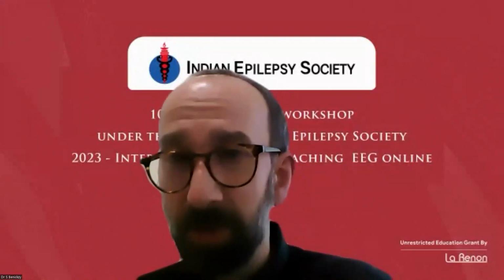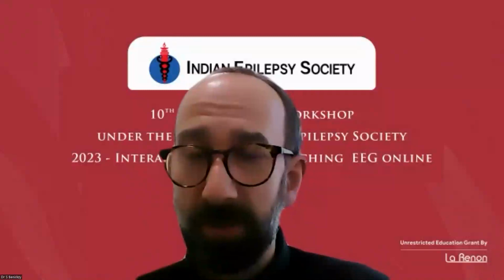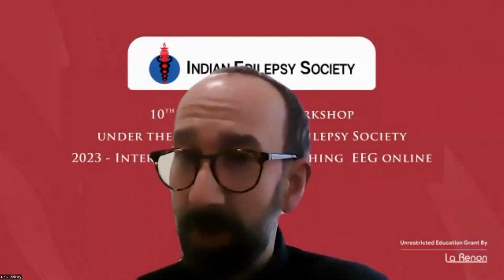So the time window is very, very important, and time is brain. The earlier you treat, the more you can save. But again, if the condition is reversible, in an intoxication for example, and if you treated the etiology and you suppress the EEG, then you have higher odds that the patient will recover, although the clinical improvement, as I said before, can lag behind the EEG improvement, but it would come. But it's very true what you mentioned, that the earlier the better.